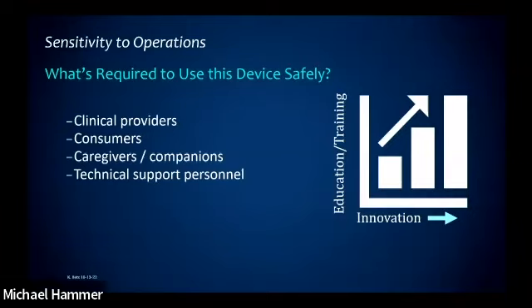I'm a huge advocate of innovation. I love all the cool new stuff coming out there, but I always ask, what's required to implement this new innovation? It's so cool, it's so neat, it does everything possible. How many days of training? I can go back to the exoskeletons, because no one's going to be offended in this room about the exoskeleton. Multiple days of training, okay?